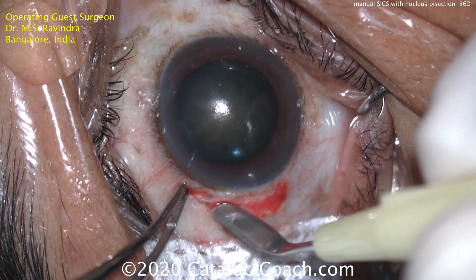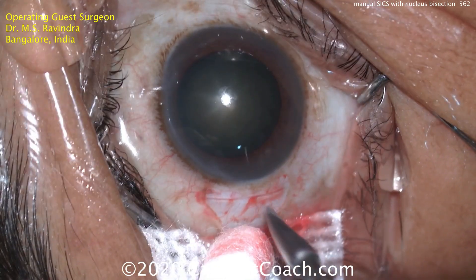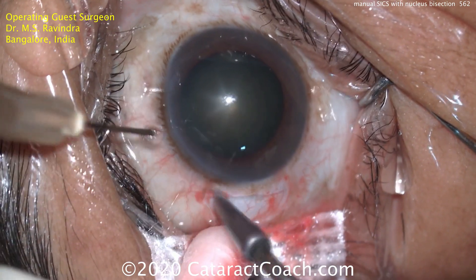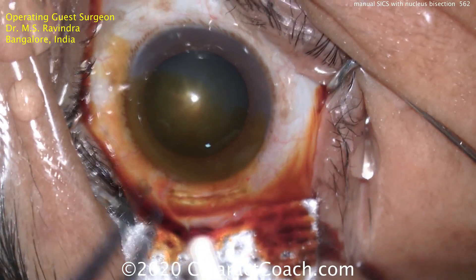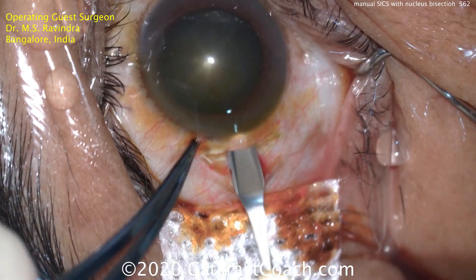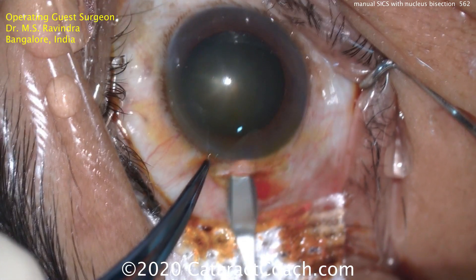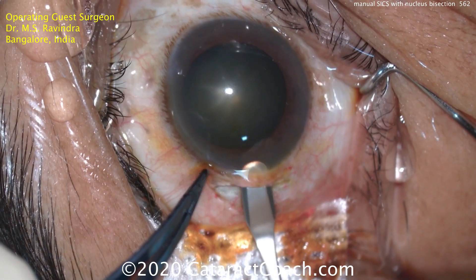Using this crescent blade, he'll do a half scleral depth incision, with a very minimal amount of cautery, and then continue to create the scleral tunnel. The key to the whole incision is the way it's beveled and the tunnel length. Watch carefully — this half scleral depth incision goes into the cornea. He's still not in the anterior chamber yet. The tunnel length here is probably two and a half millimeters or so.